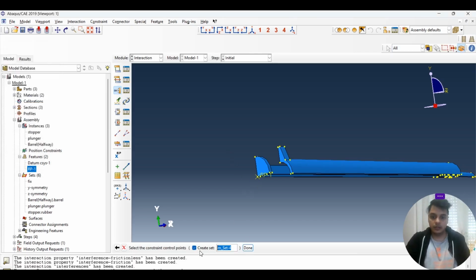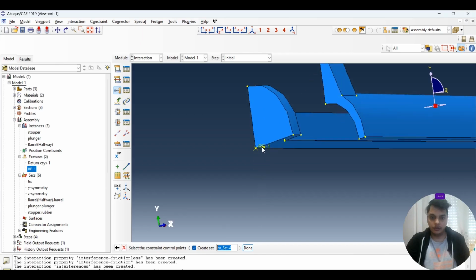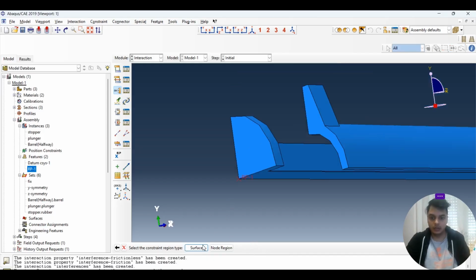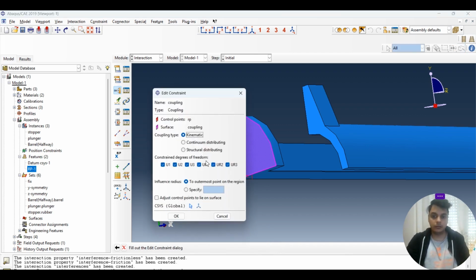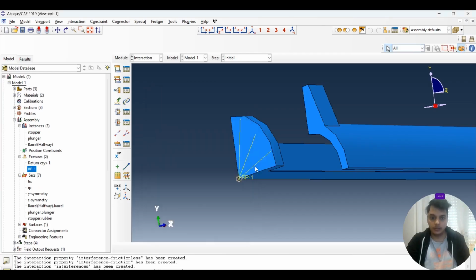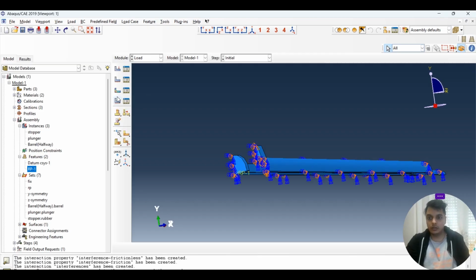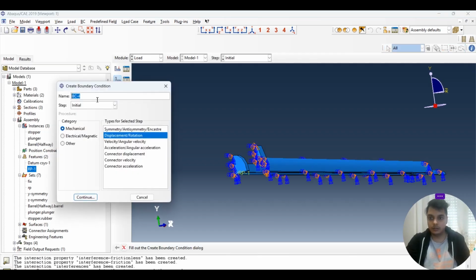Then we have to select the reference point. So this is my reference point. Again, I will search the reference point. It's done. Now I want the surface to be coupled with. So I do coupling, and I want everything to be coupled here. All fine. Now again, I go back to my load case and then define it here.